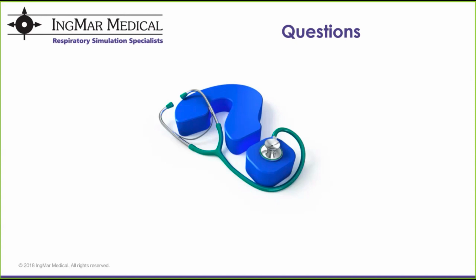Another question here from Richard. Will this work with most ventilators? That's a great question. The answer is absolutely yes. We are the universal patient, so to speak, and that means that you can use any real ventilator, and not just any real ventilator, but any mode of ventilation. Our ability to produce these realistic spontaneous efforts means that you can train on spontaneous modes of ventilation.